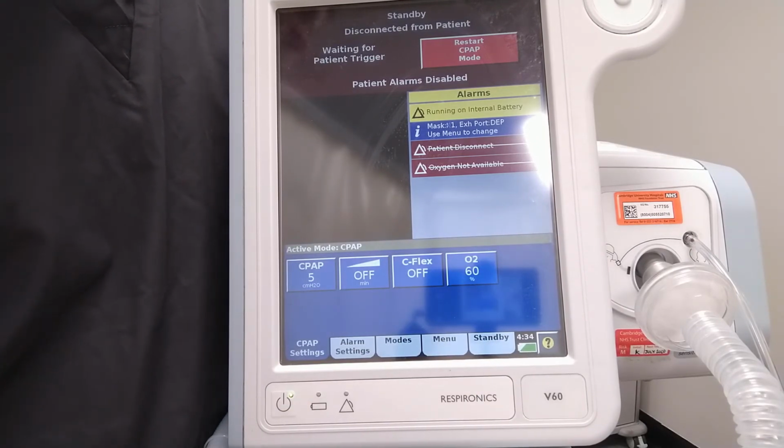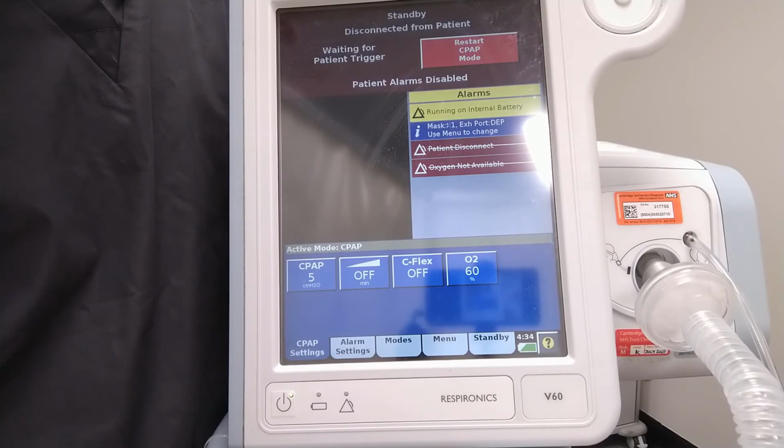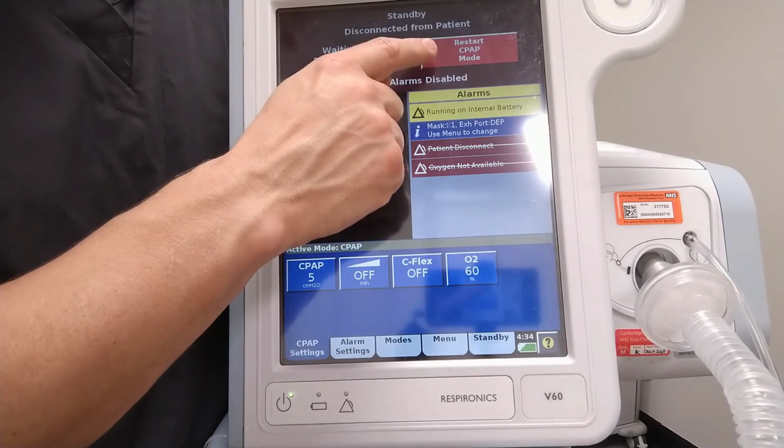There's two ways to get the machine out of standby mode. One is just connect the circuit to the patient's mask, and it will disengage itself when it detects patient's breaths. The other way is simply to press Restart CPAP up here.